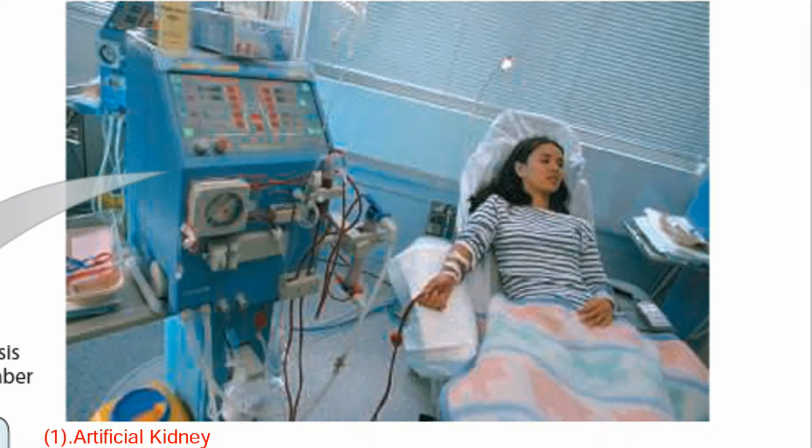I welcome you to the presentation lecture on artificial kidney. Now here on the screen, as we can see, the girl patient is shown, and this girl is suffering from kidney failure. Both the kidneys are not working, so you can understand in her blood the amount of waste material is increasing.